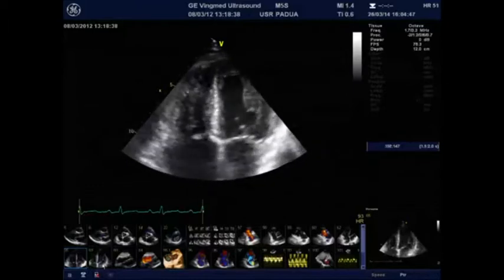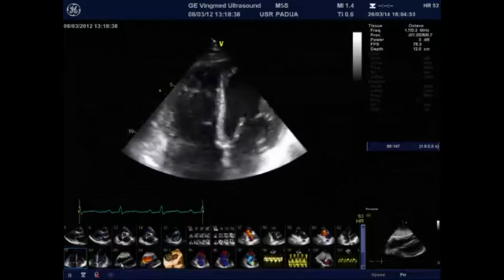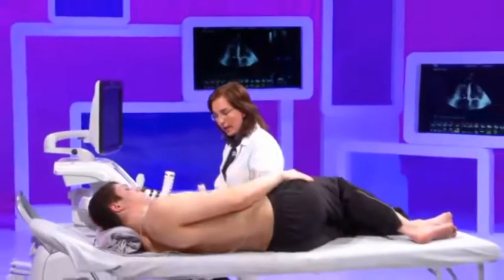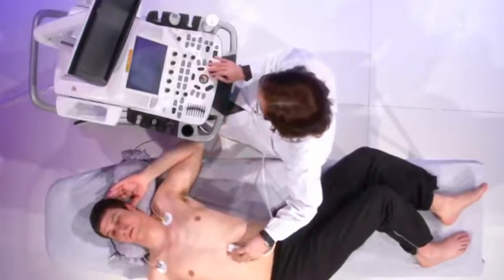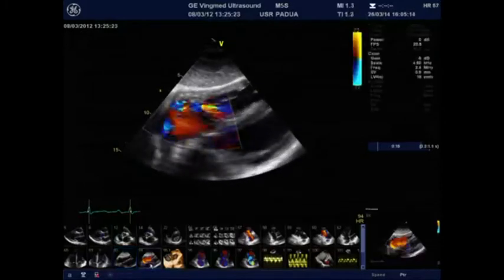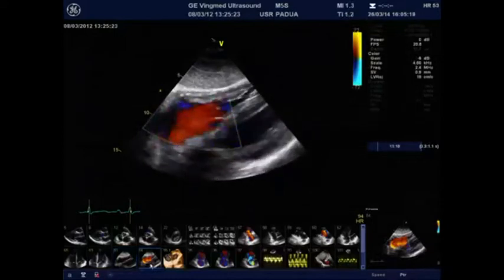And remember, there is also the possibility to approach the patient from the subcostal view for assessing the morphology of the valve. So please stay on your back. Okay, and then we can try to assess again the morphology, and we have the confirmation of an evident structural abnormality of the valve, which results also in some degree of tricuspid regurgitation, which is not very clear. Probably in this case the jet is very eccentric, and we should be able to obtain a better view.